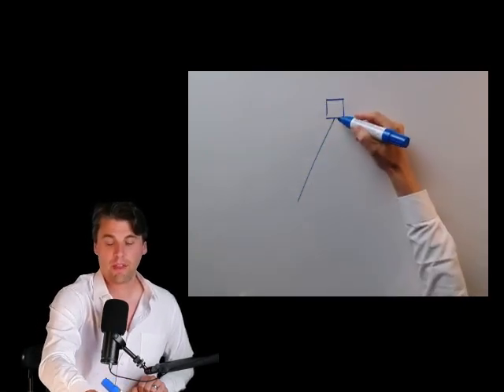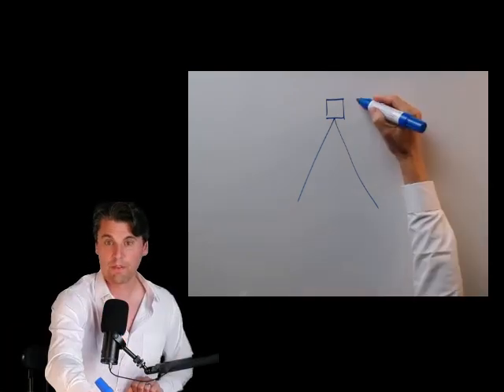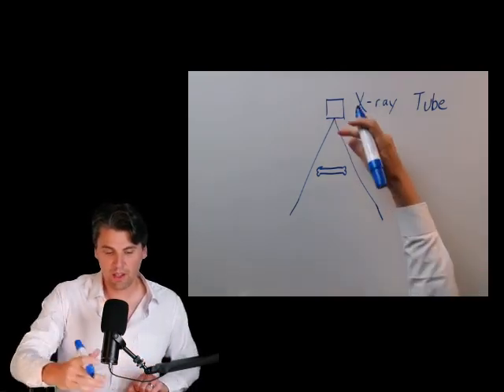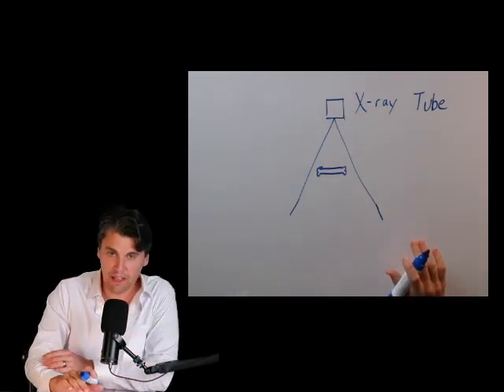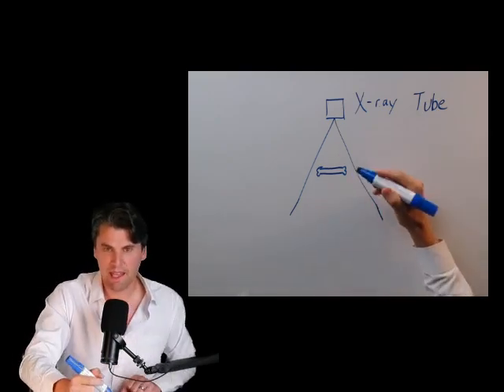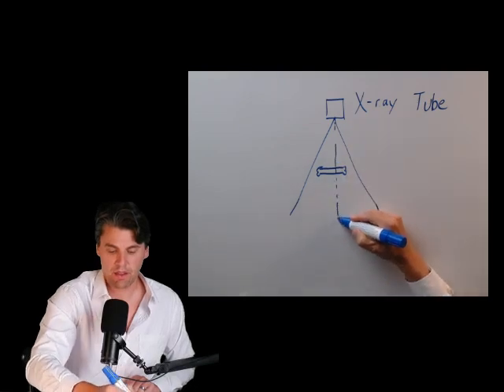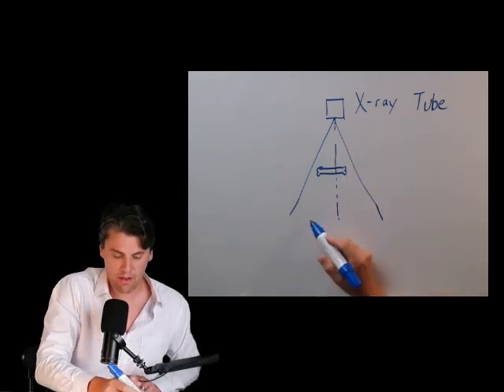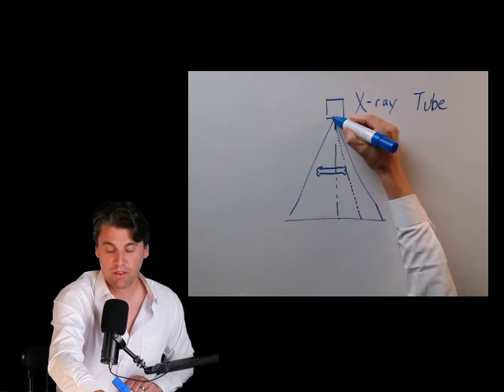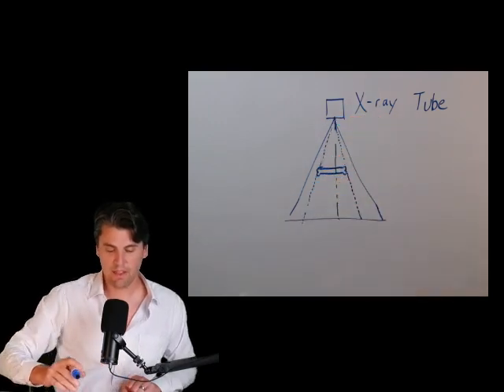And remember, the X-rays come out in a divergent manner, where they're spreading out like a cone from the X-ray tube. And typically, let's imagine you're able to position well such that your X-ray beam is perpendicular to a bone which you'd like to make an image of. Then imagine that our central ray is coming down here and our detector or our image receptor is down here in this plane right here. And you can just trace out the rays, for instance, that define the edge.